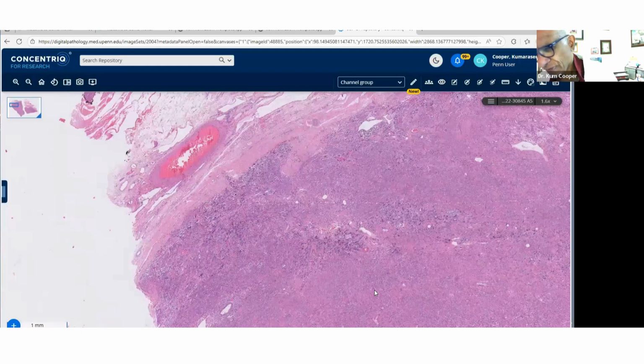There are good markers for synovial sarcoma. As you know, there are antibodies targeted towards the fusion itself, which is SS18-SSX, or SYT, or both, the fusion genes produce a protein. There are nice papers my young colleague Esther Baranov wrote when she was at the Brigham, and you can go to AJSP Baranov synovial sarcoma antibody.